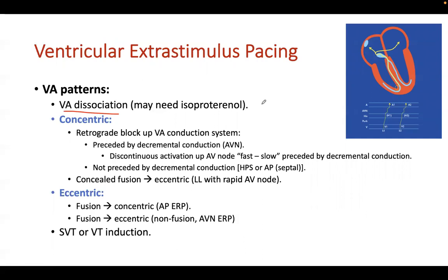Because if you don't have retrograde atrial activation, then for AVRT you're going down the AV node and up an accessory pathway, and when you V-pace you should see evidence of an accessory pathway, and you don't see it here. So AVRT is usually out of the question.